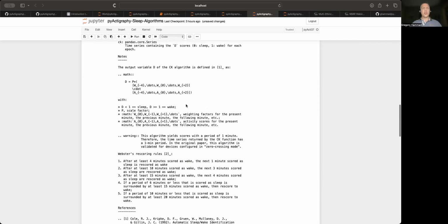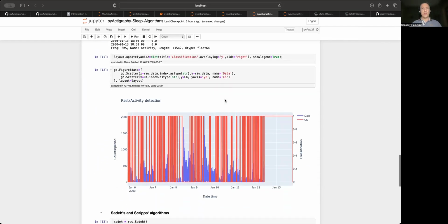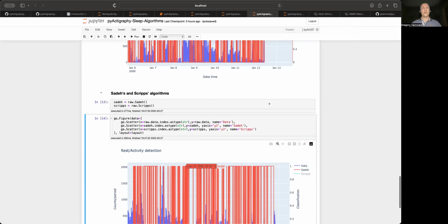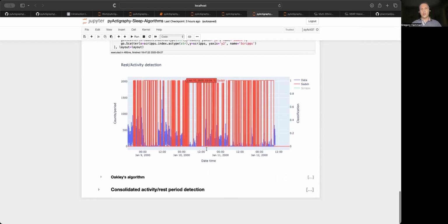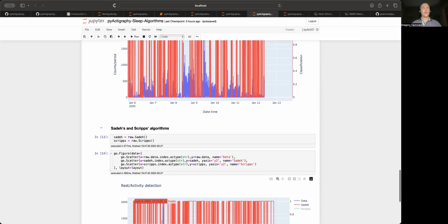And the acquisition of, I think it was the zero crossing mode, for instance, which is not the one that is used in most of the devices on the market at the moment. So it's always hard, but it makes sense. The paper dates from, I don't know, 82, sorry, 92. So you see, it's a long time ago. It's 33 years. So that makes sense that sometimes it's not extremely suitable for your own needs.